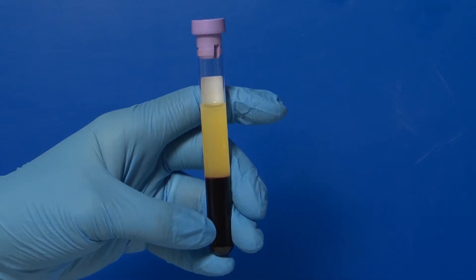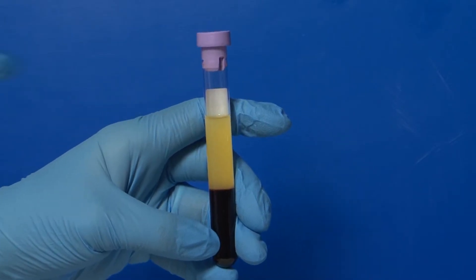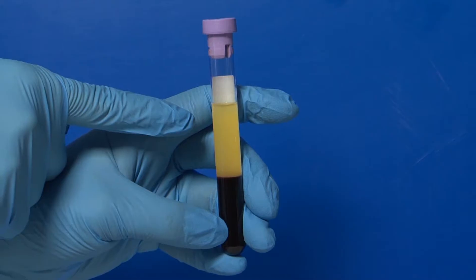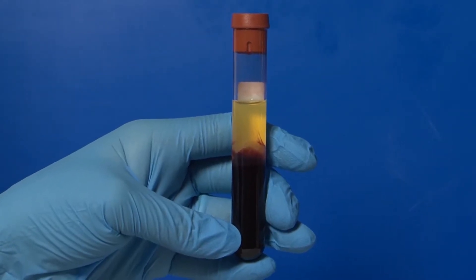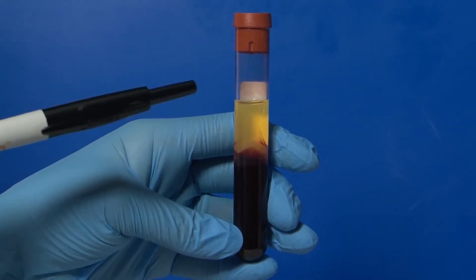Plasma can be obtained from the lavender top tubes, which contain EDTA as an anticoagulant. Serum can be obtained from the red top tubes, which do not contain any anticoagulant.